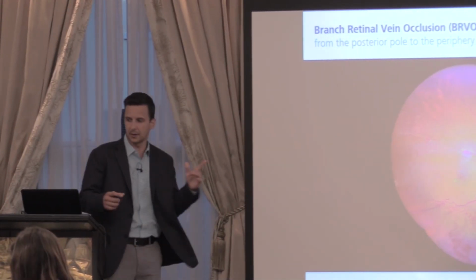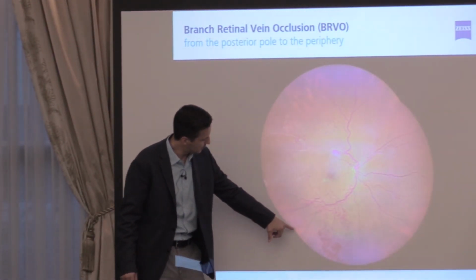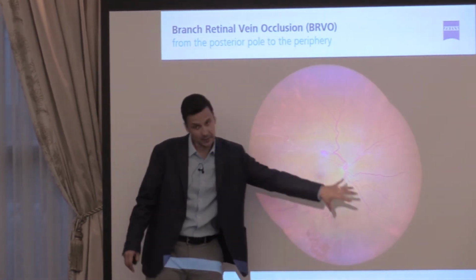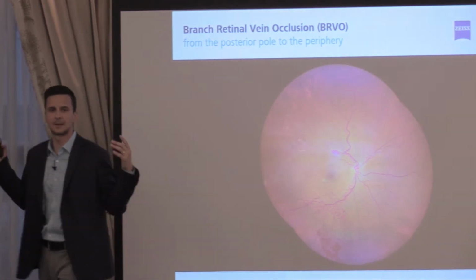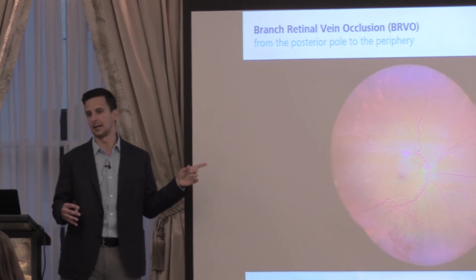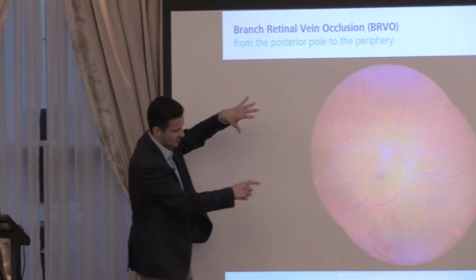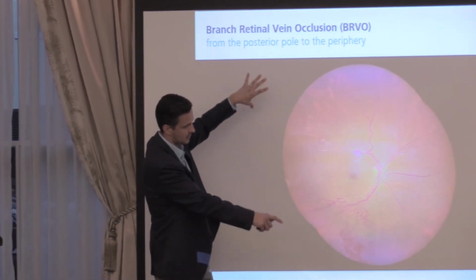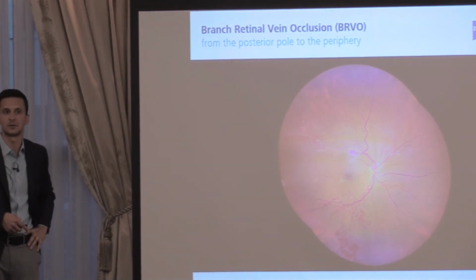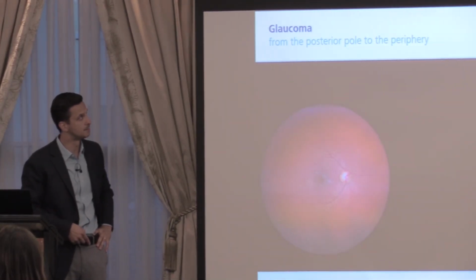This last one that I'll put in before I dive into a couple of the other slides around true color, I want you to note the edge of the image comes right here and comes right here, and this image is going diagonal. What's unique about this is not the pathology, but the angle at which the images were taken and the fact that, again, these were auto-montaged. So instead of going sideways, we knew that the pathology was sitting at like an 11 o'clock or 10 o'clock angle, and we took those 2 images, and then it auto-montaged those for us as well. Still the same clarity all the way out to the edge.